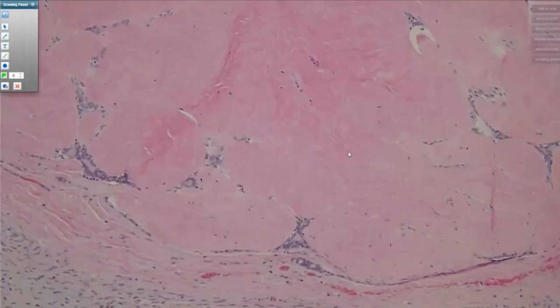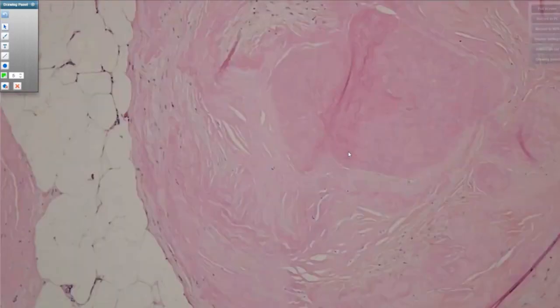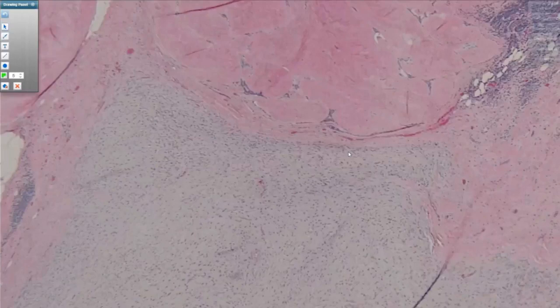So the presence of this hyalinized lower grade component with leaf-like architecture helps us classify this lesion as a malignant phyllodes without worrying about immunostains and having to exclude metaplastic carcinoma on another basis. This illustrates the importance of adequate sampling in breast tumors. Sometimes the most useful thing is going back to the bucket and putting in more sections.